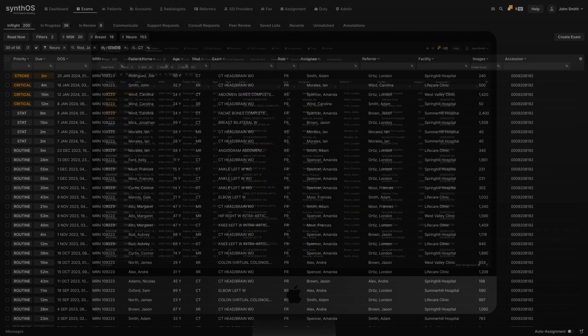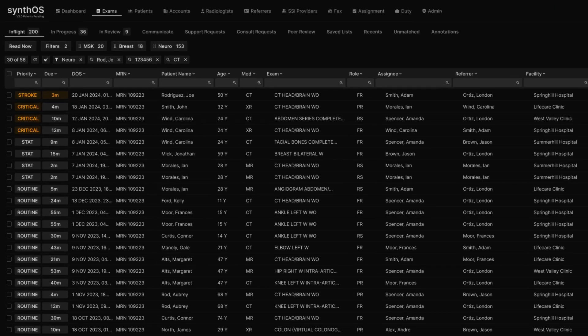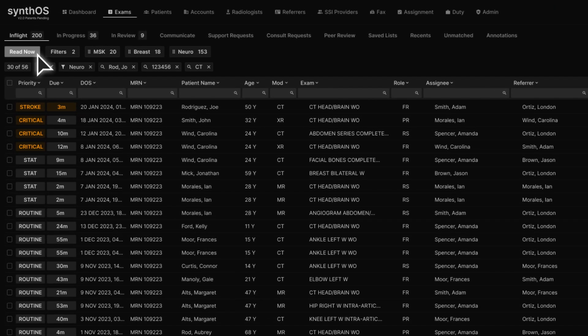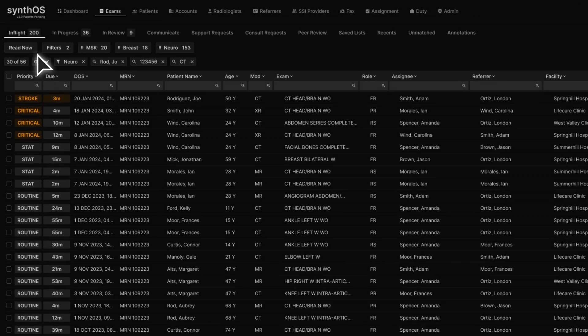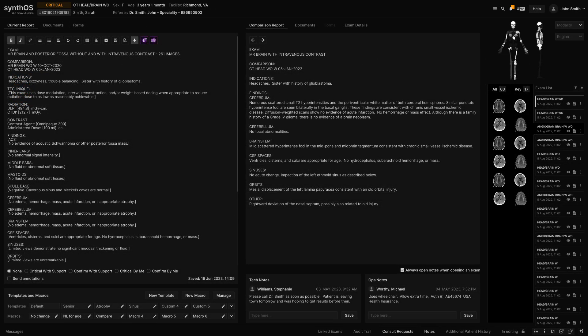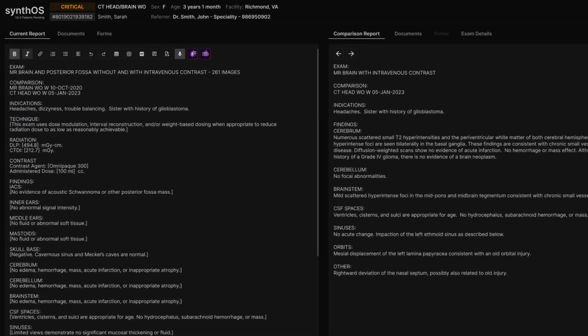From our prioritized work list, click read now at the upper left to present the oldest due exam in your queue. The prior and comparison reports are automatically displayed.